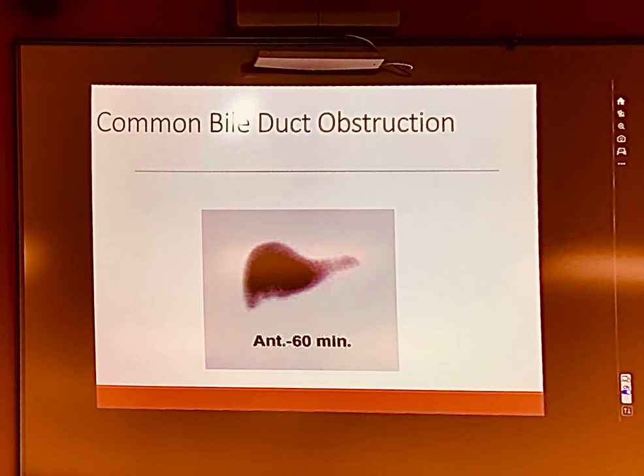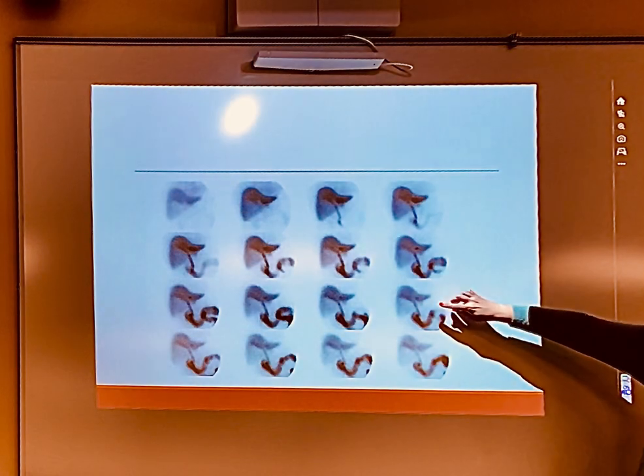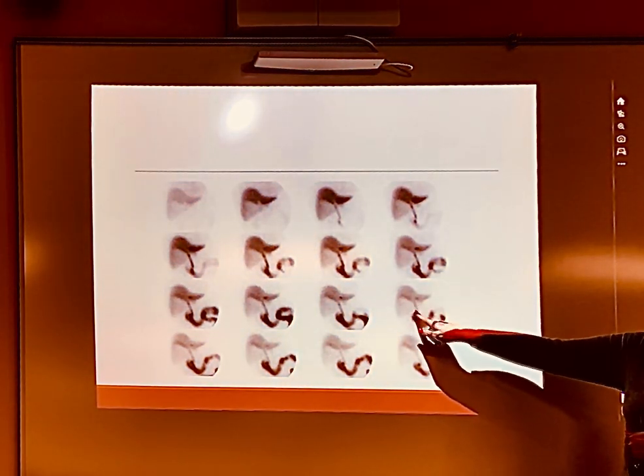So in the previous images, because there's liver and bowel, could you use morphine as a way to see if it'll take in the gallbladder? It's too far out. I don't think a radiologist would tell you to give morphine to this patient, because you're way past the CBD. You don't have a lot of ductal activity.